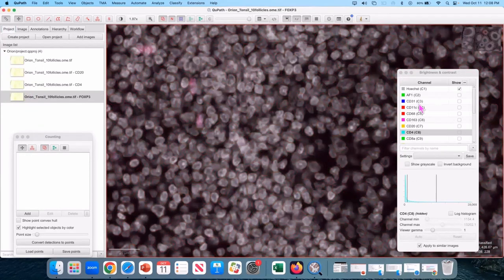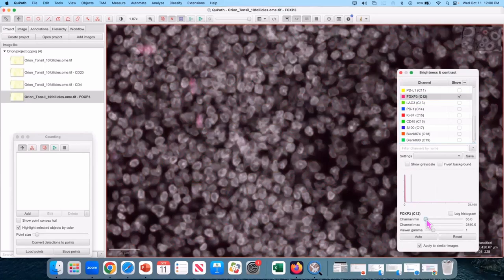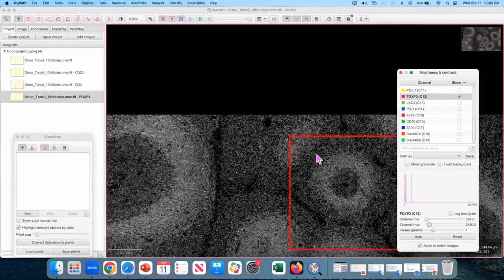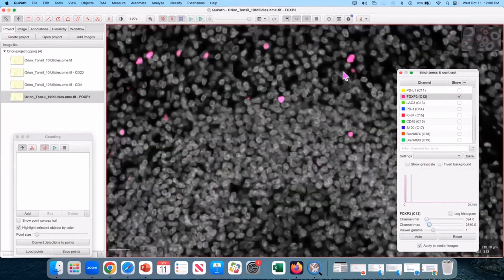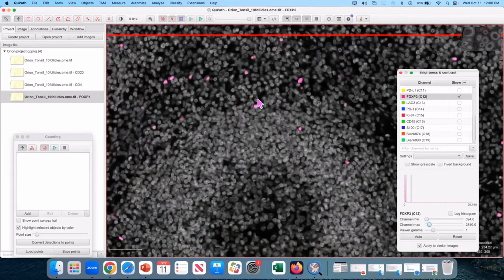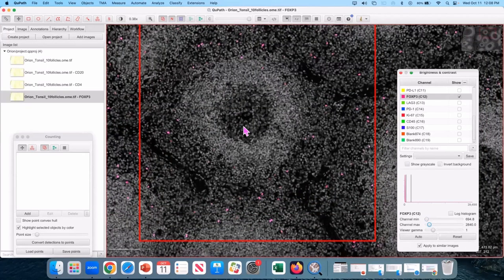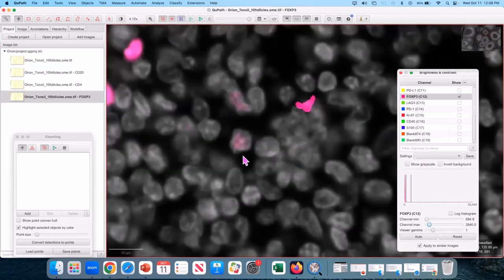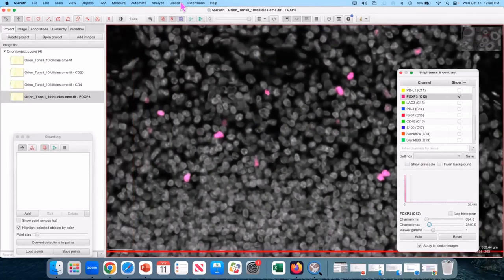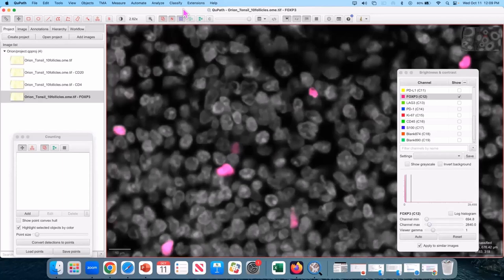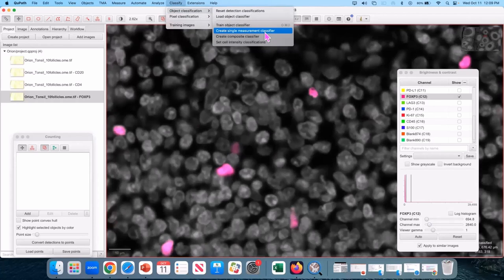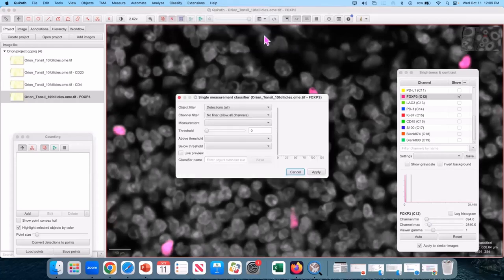This might be more of a personal note, but for markers that are expected to be localized in nucleus and nucleus alone, such as transcription factors like FOXP3, I'd personally like to use only FOXP3 nucleus-related features. Your mileage may vary. It might be better to use all features as shown before. Up to you guys. Because the FOXP3 is actually the cleanest of the markers we've looked at, I'm actually not even going to bother training. I'm just going to make a single measurement classifier. And as Mark said, I'm going to use nuclear FOXP3.